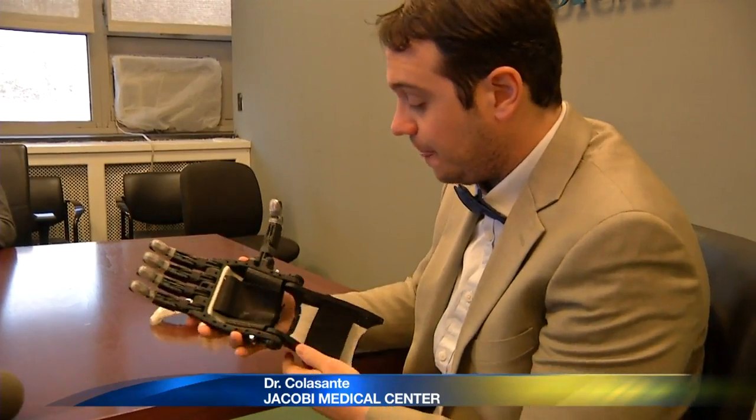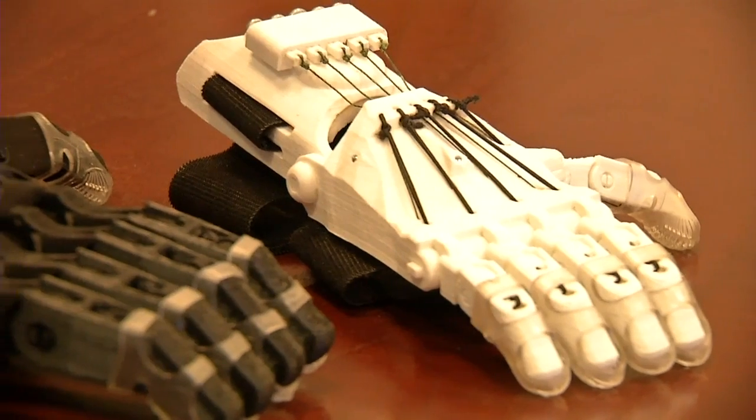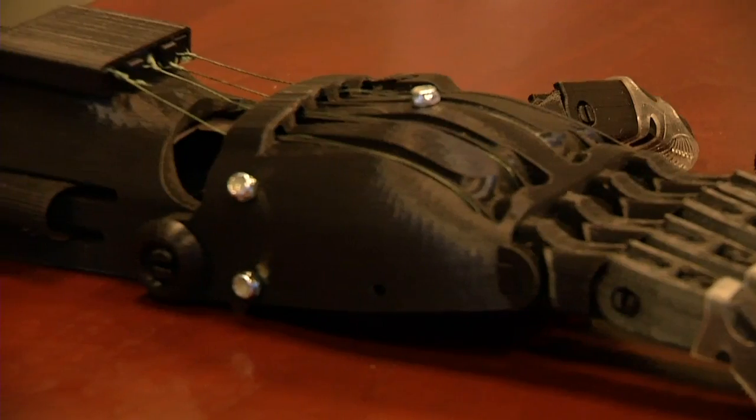These are body-powered prosthetics, meaning the patients have the wrist but not the fingers. The palm of the hand goes right here, and when they flex the wrist it closes the fingers, allowing them to grasp. We can make any modifications on site and customize them to the patient, making it a more interactive experience.